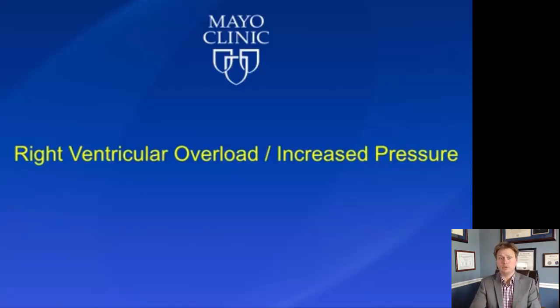So I don't want you to confuse this by thinking that you have a grossly normal echocardiogram and you do not need to pursue the workup of PE any further. That is not the case. But particularly in patients who are hemodynamically unstable, in peri-arrest periods, or if you are trying to determine whether the presence of a pulmonary embolism represents a submassive or massive state, that would be considerations for either a higher level of care or other interventions like thrombolysis. This can be very useful.